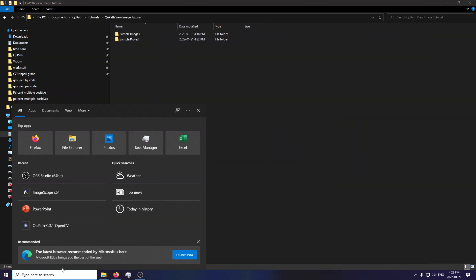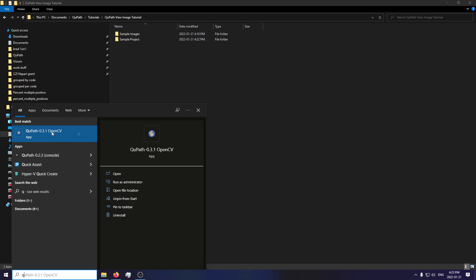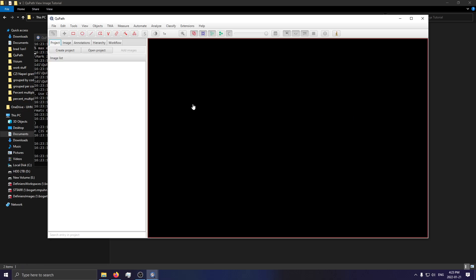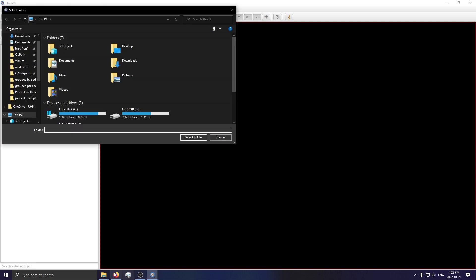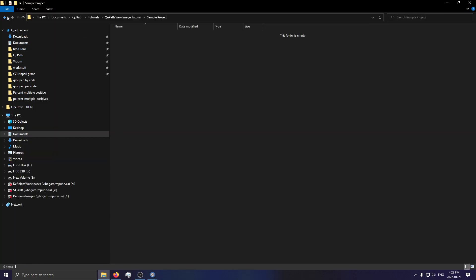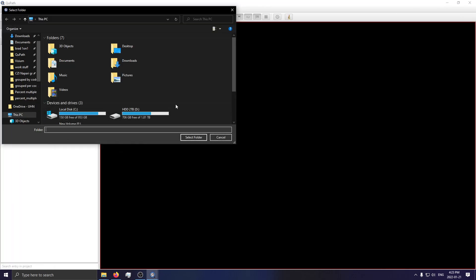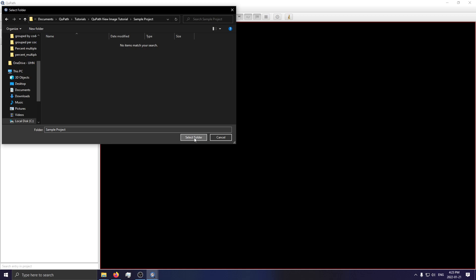Now that you have it downloaded and installed, we can go ahead and launch it. I'm just going to launch the older version — it will ask me if I need to update, but I'll skip on updating it for now. The first thing we want to do is click the button that says "Create Project." A while back, we made an empty folder called "Sample Project," and you have to make sure it's empty — that's really important. Copy the location of this empty sample project, paste it where it says "Select Folder," hit Enter, and then Select Folder. Now you've created a project, but with no images loaded into it.